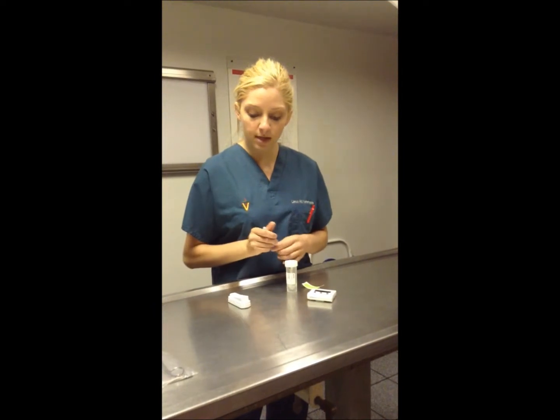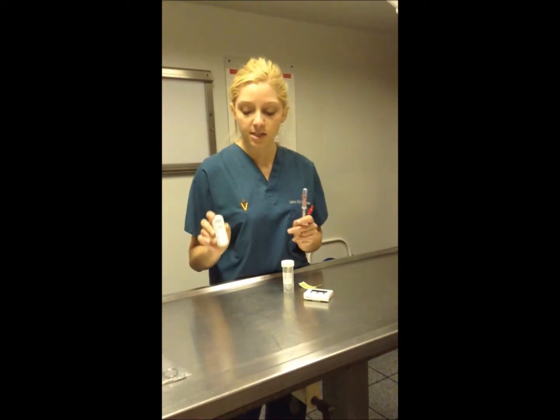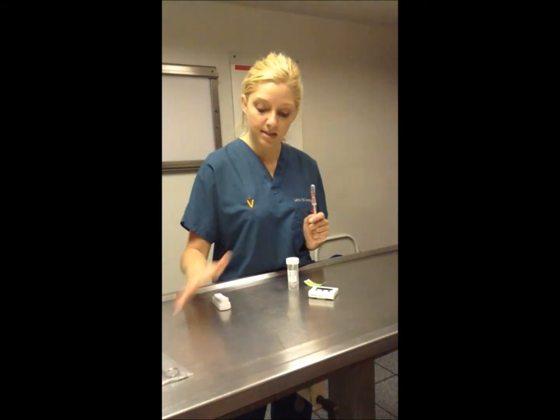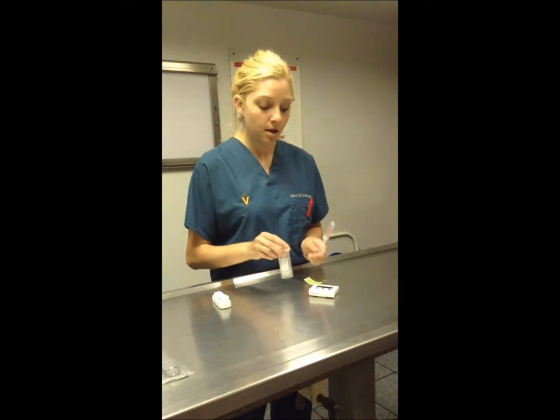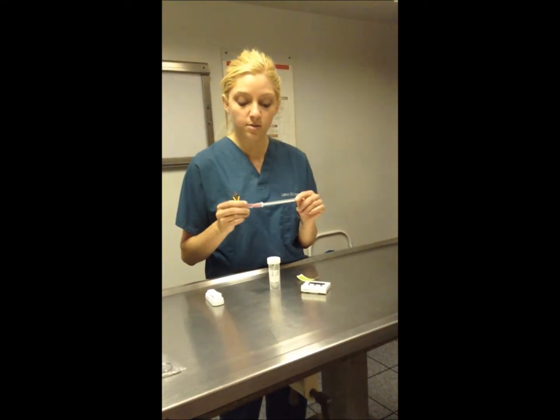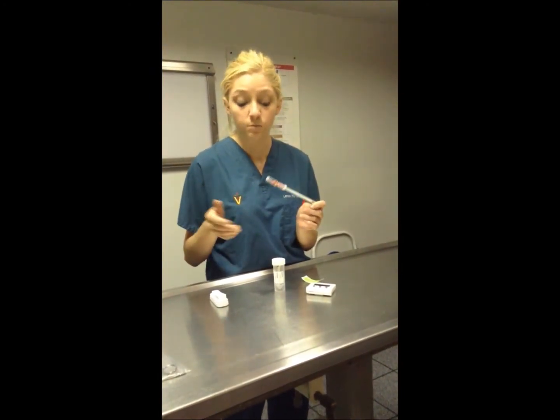I'll show you how we do a Giardia ELISA test. So they're called snap tests, because when you actually put the solution in, you have to snap the piece down so that the test starts to run. So we're going to do a Giardia. So it comes with these little sticks, and these tests are always refrigerated. You leave them out until they get room temperature.